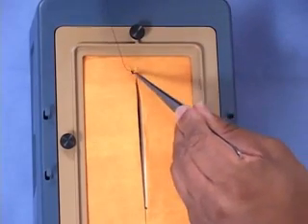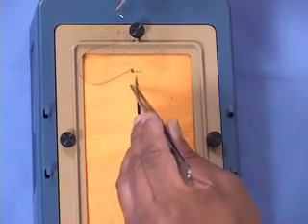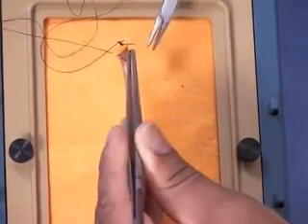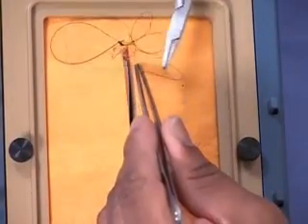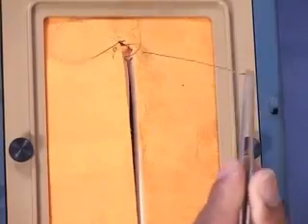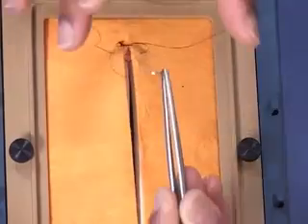Next, I'm going to demonstrate the running locking stitch on the skin simulator. Notice that the first stitch has been placed and tied. Now, you'll start by elevating the far side so that you have clear visualization and pass your needle through. Now, you'll come over to the near side, elevate, and pass your needle through again. The key to the running locking stitch is to retrieve your needle always through this loop.